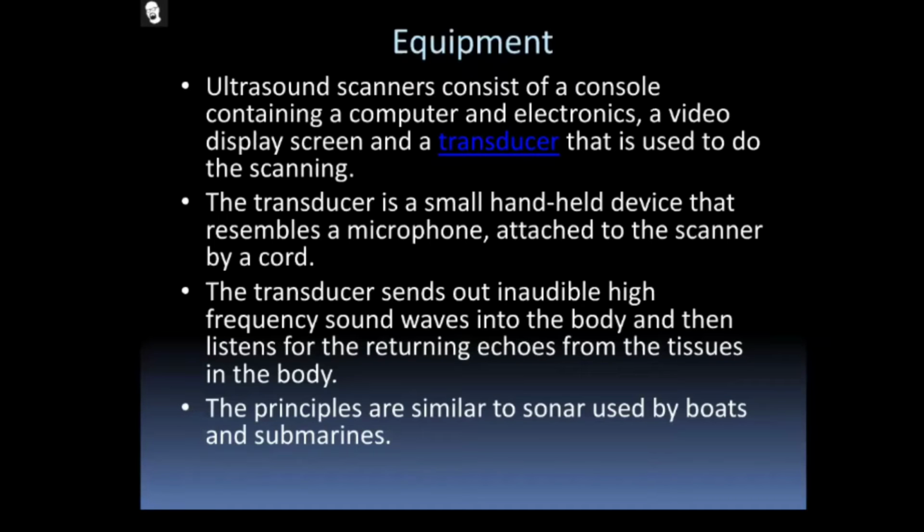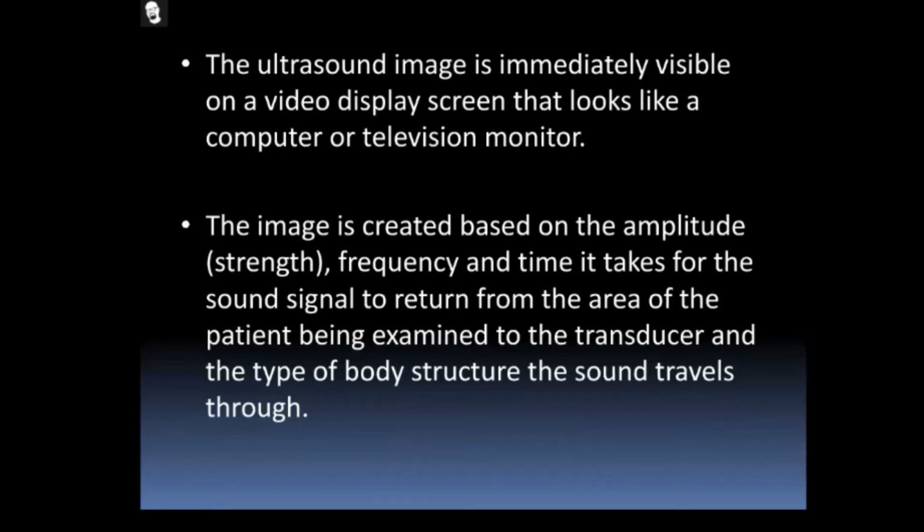Whatever the medium may be, it can pass the sound wave. Actually, a liquid medium is very comfortable for the transducer while sending the information and receiving the signal. And then the ultrasound image is immediately visible on a video display screen that looks like a computer or television monitor. Within a fraction of a second, we can see the video. But in between the probe and the monitor, thousands of processing steps happen, converting all the images. The transducer is not responsible for showing the image on the monitor. Its only purpose is sending the sound waves and receiving the sound waves.